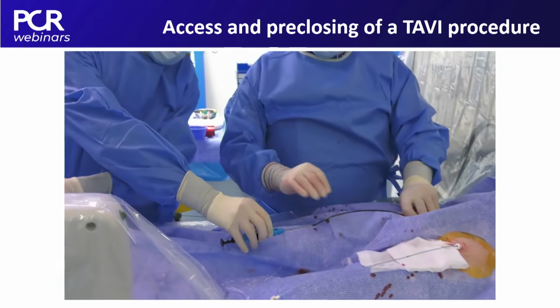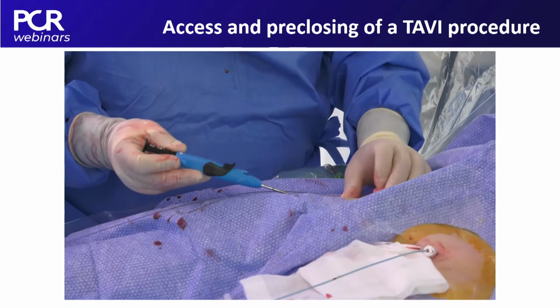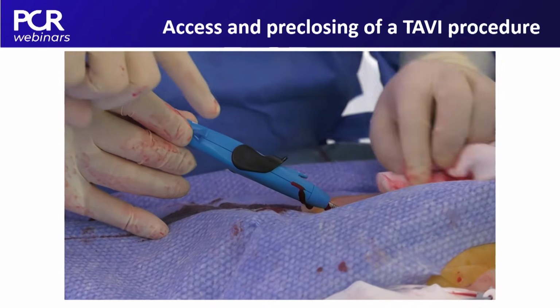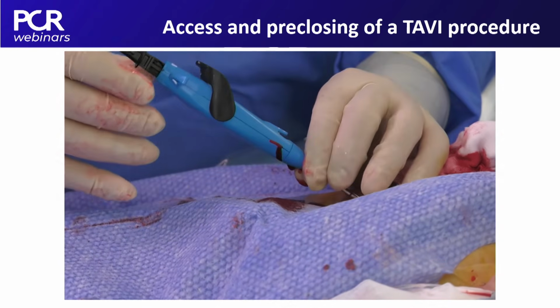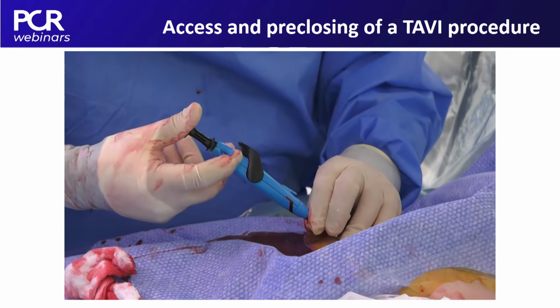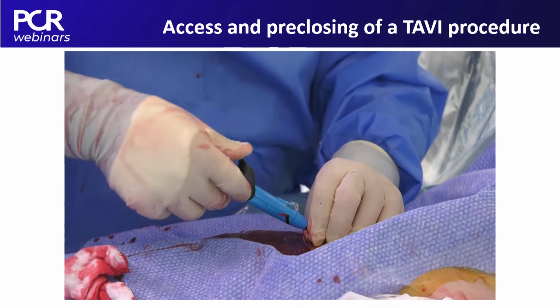And now the ProGlide is inserted in the artery. It's really hydrophilic. You can really feel that it goes smoothly. As for the ProGlide, we remove the wire as soon as the marker is at the edge of the skin, and we introduce the device up to where we are in the arterial lumen, so we see the bleeding. We lift the number 1. It's really important to keep exactly a 45 degree angulation in order to have the pedal of the Prostyle parallel to the arterial wall and to puncture the artery perfectly.